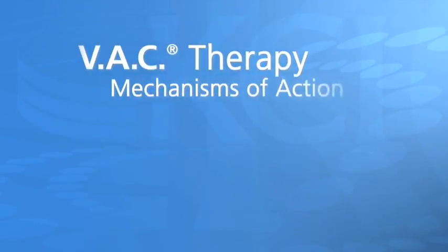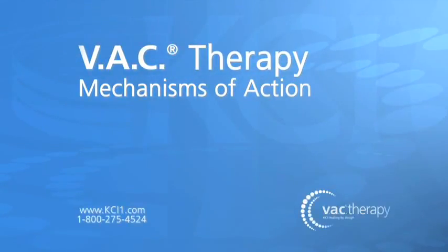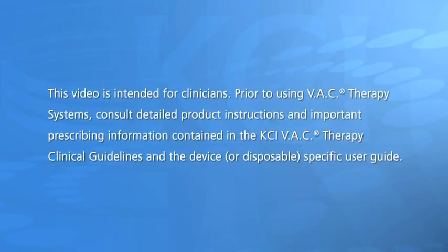VAC therapy mechanisms of action. This video is intended for clinicians.